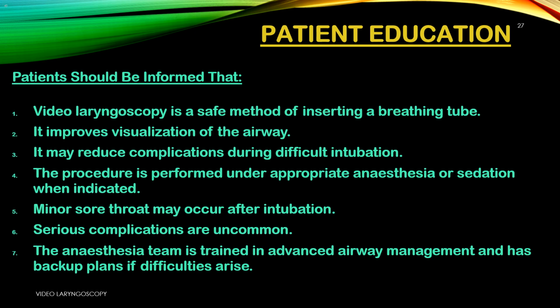6. Serious complications are uncommon. Major problems are rare with modern equipment and trained staff. Safety is the top priority. 7. The anesthesia team is trained in advanced airway management and has backup plans if difficulties arise. The team is prepared with other devices and techniques. You are in experienced hands if the airway is challenging.